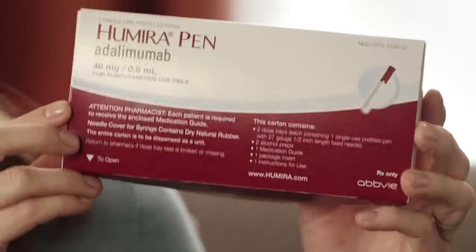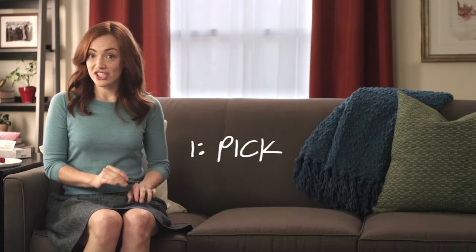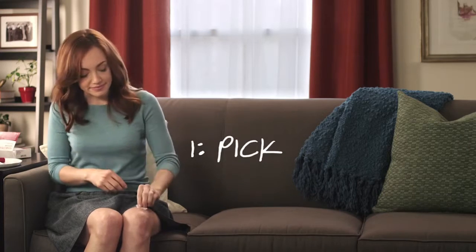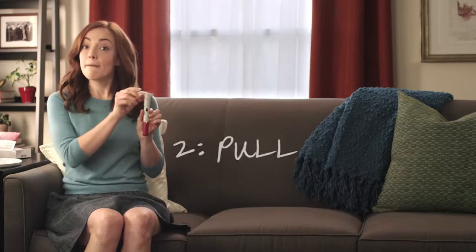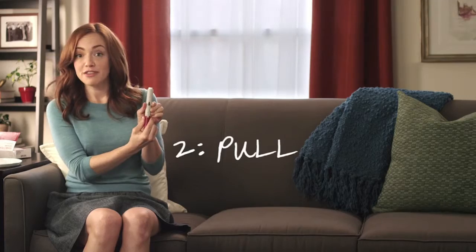Even after you've learned how to inject from a healthcare professional, it can be hard to remember all the steps when you start doing it at home. A helpful way to remember is by following the 4 Ps from the Quick Tips Guide, which you'll find inside the Humira package. First, pick an injection site and with washed hands, wipe it clean with an alcohol swab. Next, pull the gray cap and then the plum-colored cap off the pen.